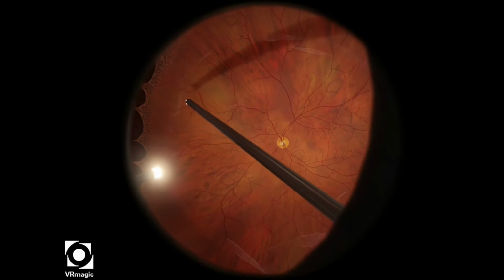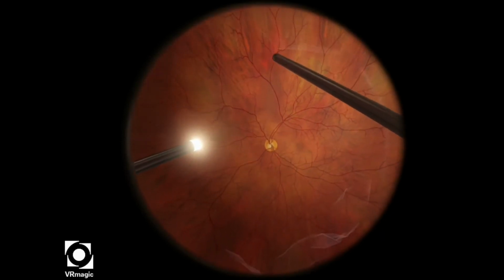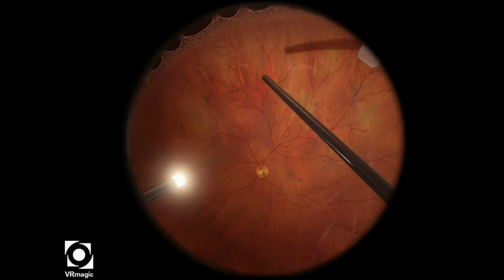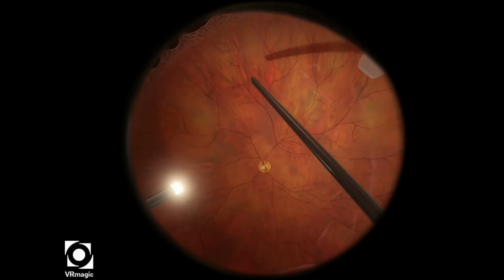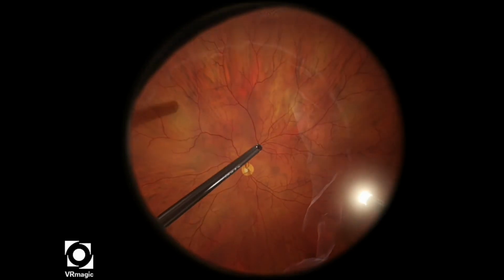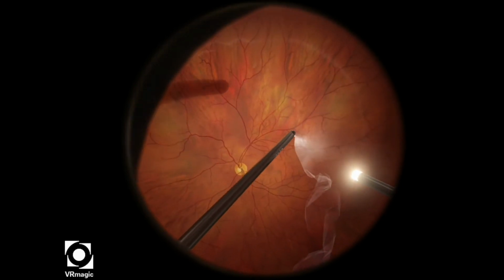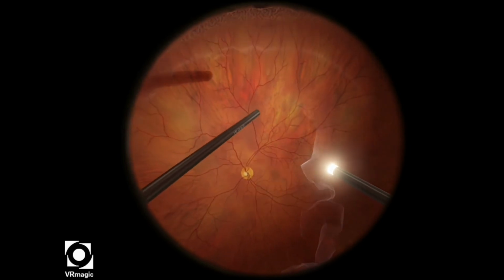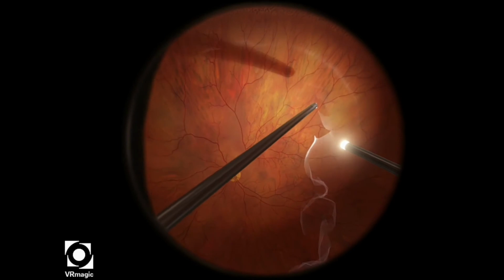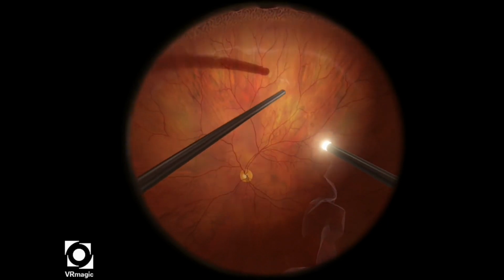As I mentioned in my previous video, you don't want to try to shave close to the ora serrata. It won't necessarily give you more points, at least on this simulation, and it doesn't necessarily reflect in real life where you can use your light pipe to sclerodepress or have an assistant depress for you while you try your best to shave as close as possible. Chandelier lighting is also an option in real life that's not here in this particular case.